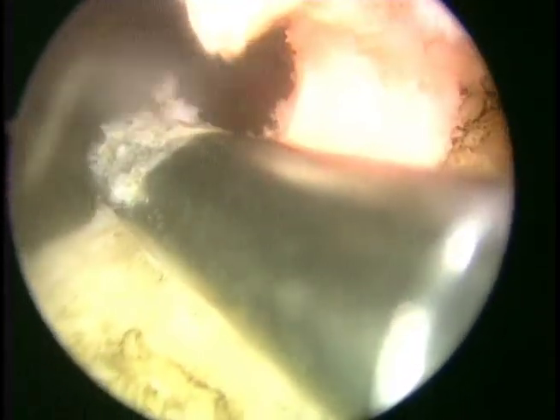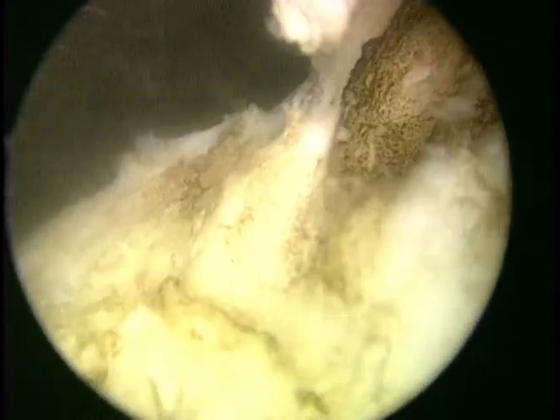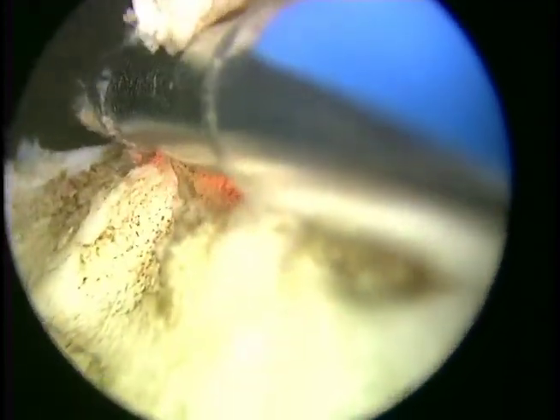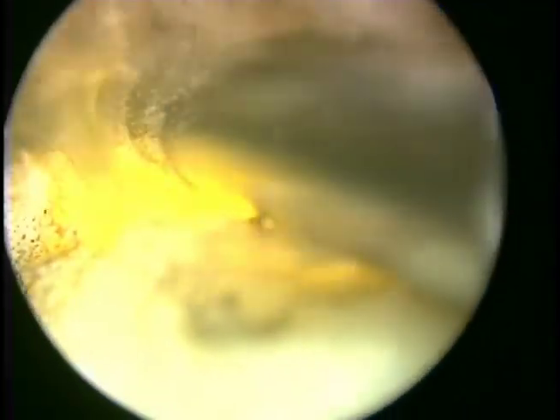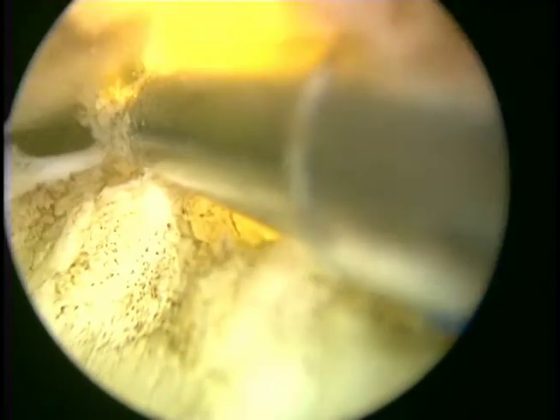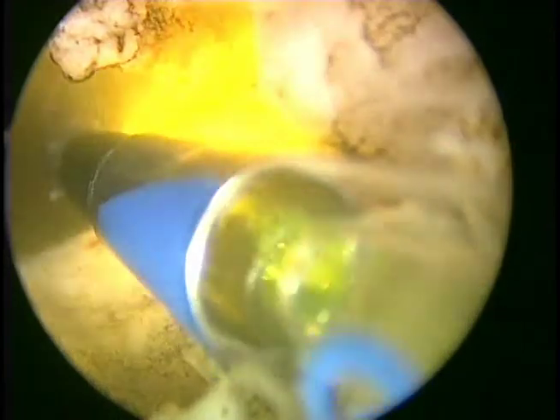Here we are just taking the time to assess the lower floor amount of tissue and, using our laser fiber, debulk a good chunk of the adenoma. Note the ease with which this fiber, especially compared to the second generation fiber, is quite robust, is able to withstand being in contact with tissue, and creates a nice opening upon passage over the tissues. This is now at 120 watts, and we can see the effect it has on tissue removal.